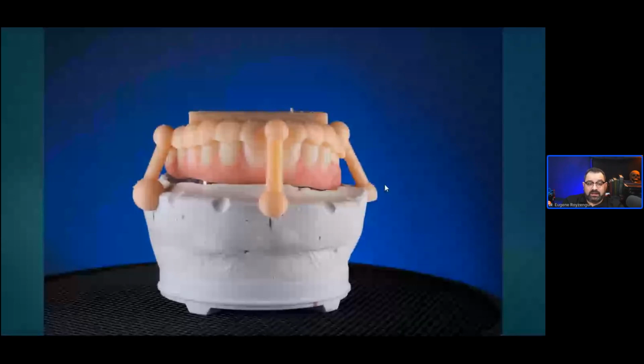And if down the line, for example, with hybrids, you guys know that hybrids don't last forever, obviously. Down the line, the patient will need a retread, for example. We will keep the bar, but we need to replace the teeth and everything. As long as I have the model, I can still print another one of these if we lose it, and position the bar back onto the model, do some gingival adjustments when necessary, and just reset the teeth to the same ideal position. I mean, there are many different things you can do.